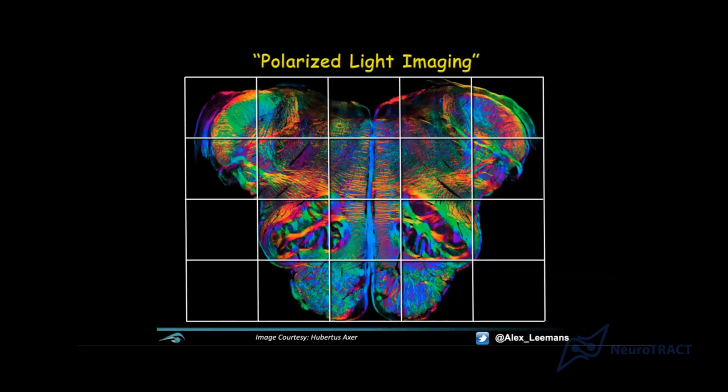Anyway, so you could argue, well, use PLI as a validation. And indeed, it's another technique that has, let's call it converging evidence then, if the results are the same. But it's not a golden standard on its own, because this technique is not perfect either, right? It has to section the data.